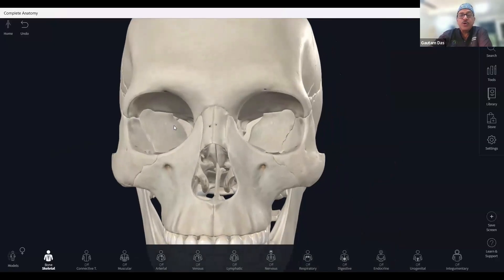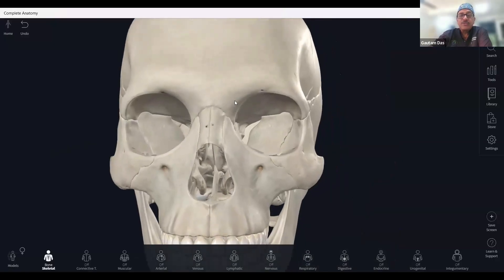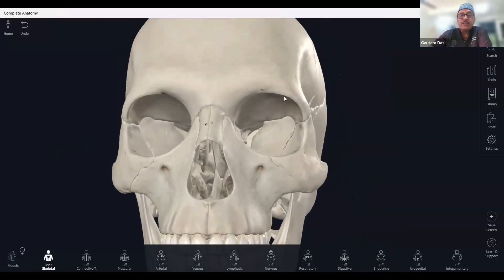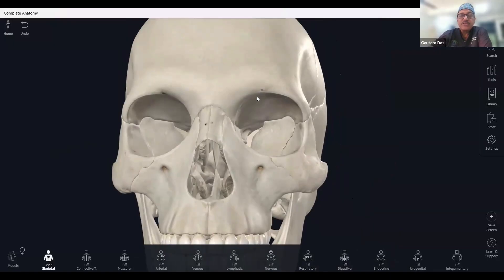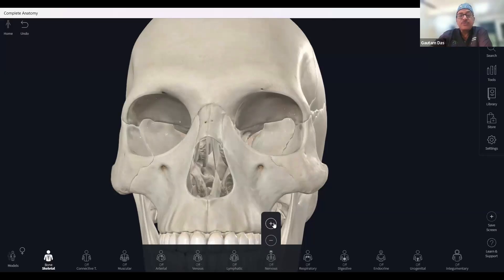Supraorbital. So here is the supraorbital now. This is over the roof of the orbit. Here you can see the small foramen, and through this small foramen the supraorbital nerve is coming out. You will see the nerves are coming out — this is supraorbital, this is supratrochlear.